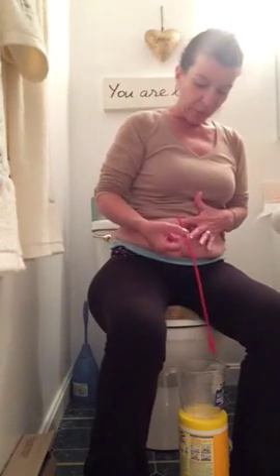So we're going to insert this, and it doesn't hurt at all. There are tighter places along the beginning of the pouch that are put there on purpose to help keep urine from coming back out the stoma. When you first get this done, it's tender, but it is not painful. You don't feel anything. You feel pressure when it goes through those little tight spaces, but it is not painful. It's never been painful to cath.